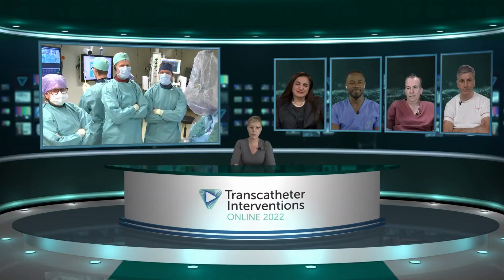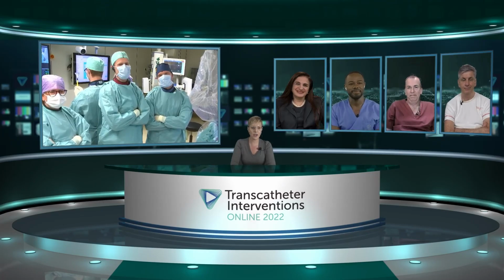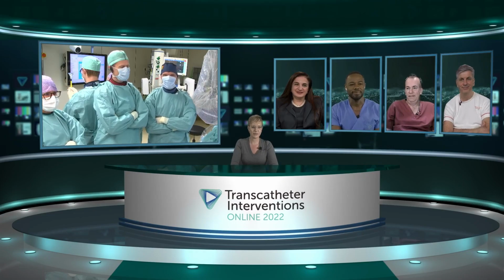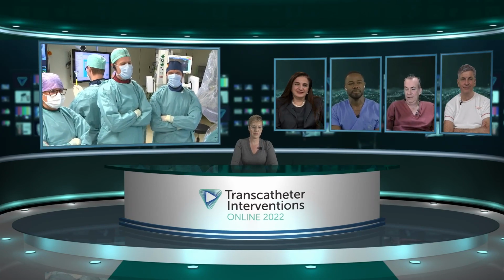Joining me today is Didier, Roxana, David, and Lars. And tell us who's with you there and what you are going to show us today? Yes, it's good to be back here in the cath lab. We are in the Alain Cribier room here in the Erasmus Medical Center.